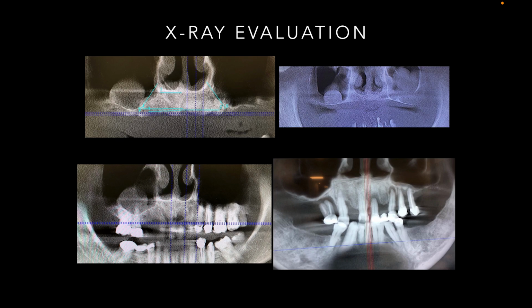Therefore, you've got to go zygoma here. I have no bone in those distal aspects to place any angled implants. Anteriorly, we do. Anterior is fine. We can put our 2 implants in. But in the posterior region, this is where I choose to do zygoma, not only because the sinus is pneumatized, but those large infectious areas. So this is how I kind of make a determination of whether I'm going to do a zygoma or not, to give the proper AP spread, obviously, in those situations.